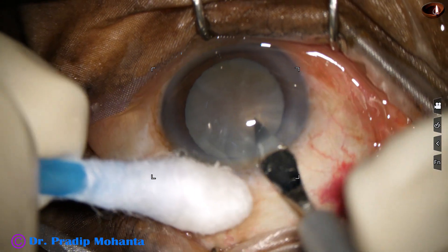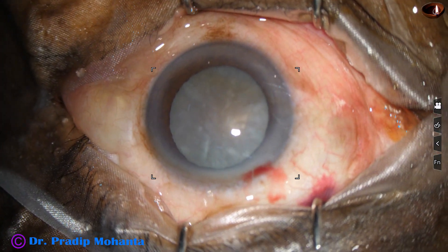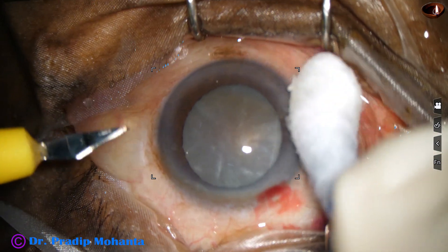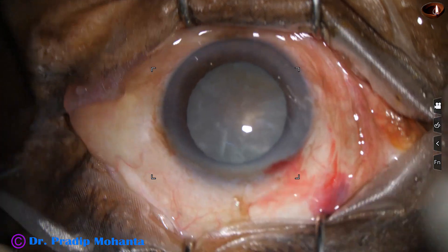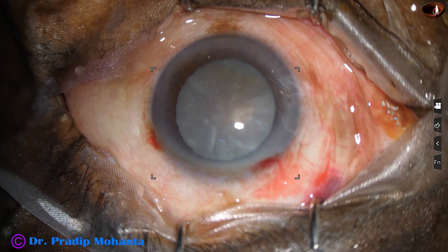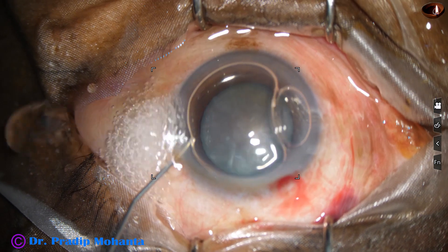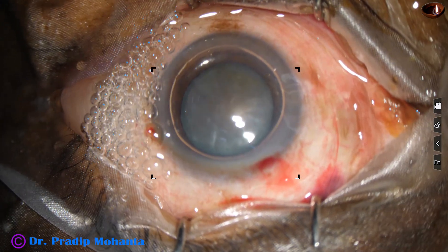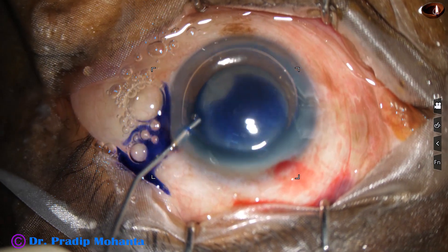This is the main incision with a 2.8 mm steel keratome on the posterior aspect of the limbus. And this is a side port on the left side of the main incision. There is some oozing of blood from the incisions and that is fine. Healing becomes better if we include some capillaries in the incisions.